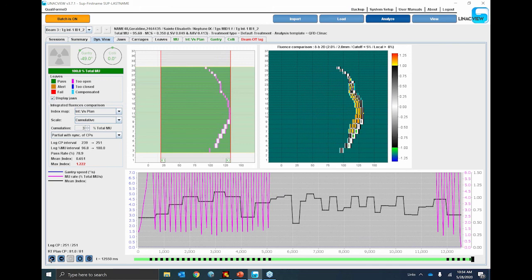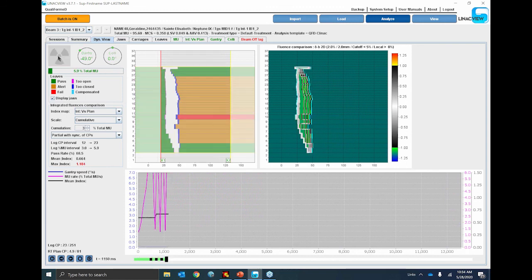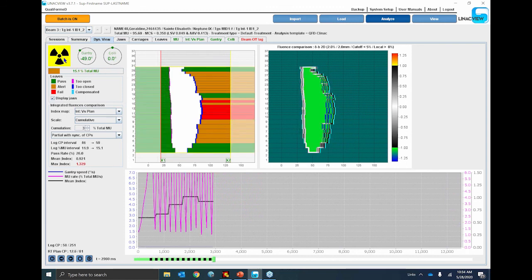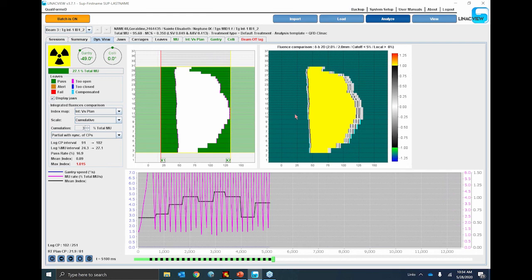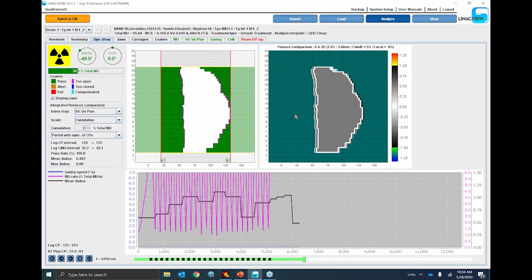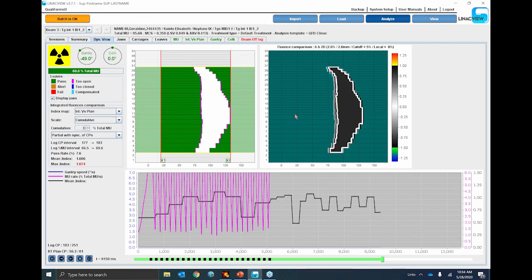In some cases, I can play it once more so you can look. In some cases, when that coloration is being shown, you can see the beam is on. So right now the beam's on, and you can see a good deal of coloration, but it's going on and off. So the mechanism isn't working quite as nicely as we would like as the plan is being delivered. This is really a complex plan, and it's not being delivered quite as we would have desired.